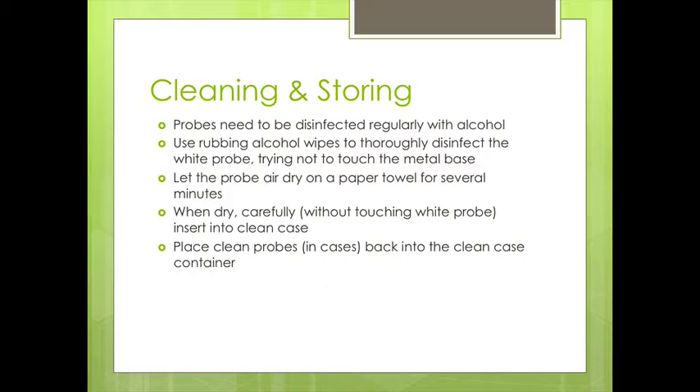The probes need to be disinfected regularly. We do that with alcohol — using rubbing alcohol wipes to thoroughly disinfect, or using alcohol liquid. We may also use peroxide from time to time. We try not to touch the metal base, just the plastic component. Then we let the probes air dry on a paper towel for several minutes. When they're dry, we carefully, without touching the white component, put them back into a clean case.